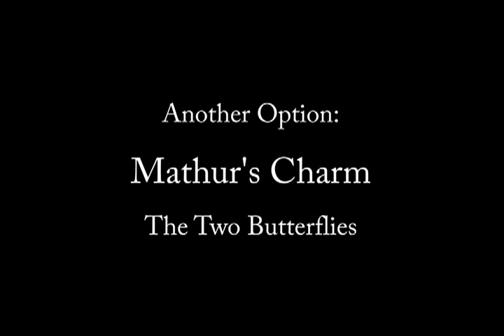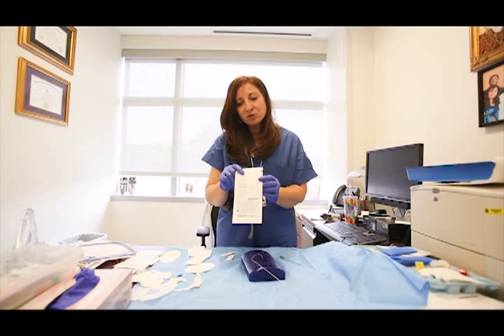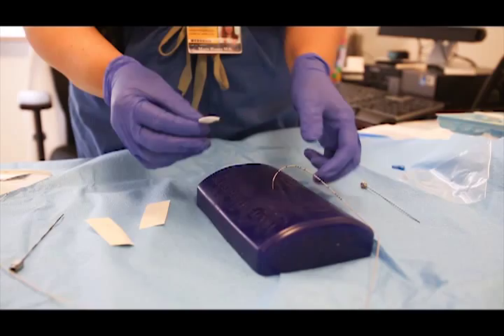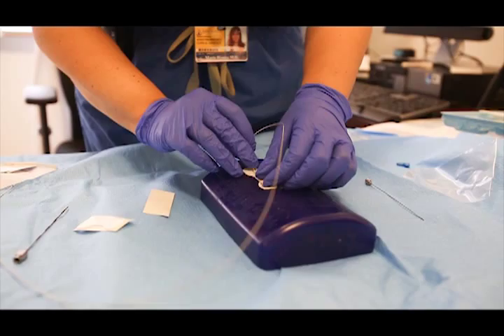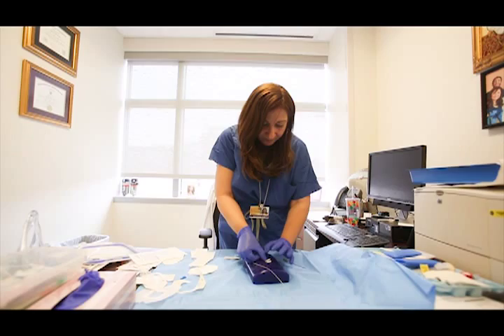A second way: with the small SORB-A-View, you take out the two white pieces from it. You still want to tape it at 12. Put one white piece down, then place the catheter on top like this, and then put the other white piece on top — so two white pieces sandwiching the catheter.